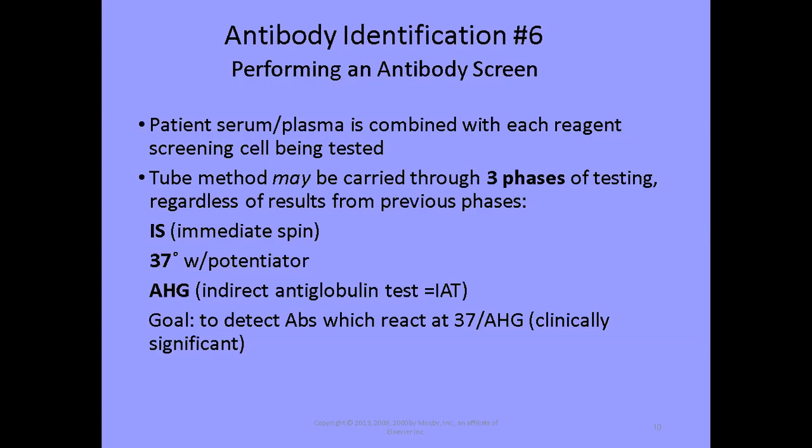Once that incubation time is over, I'm going to take those 2 tubes, and once again, I'm going to centrifuge and read them. And maybe they're going to be negative. Maybe I'm going to see some agglutination. If I see agglutination, once again, I grade the reactions, and I'm moving on to the last phase regardless of what I got at my previous phases.